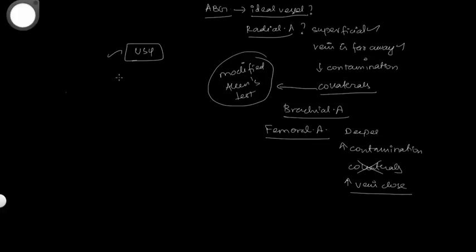And what is the ideal anticoagulant of choice for the ABG? It would be heparin. In laboratory practice, heparin as an anticoagulant is used for very limited conditions. ABG is one such condition. For example, you would use heparin in the osmotic fragility test, which you do for hereditary spherocytosis. So how much heparin would you use?